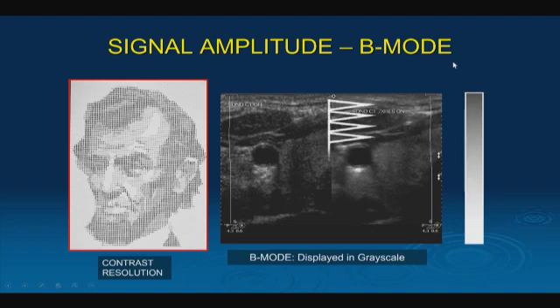So internally, what the system sees when you're scanning is a series of spikes that are at a specific depth in tissue. On the right side of this image, and all images will have centimeter markers on them, so you know what depth the structure is at. And when we're scanning, a key thing to remember is that whatever structure your sound wave interacts with first, it displays first at the top of your monitor.